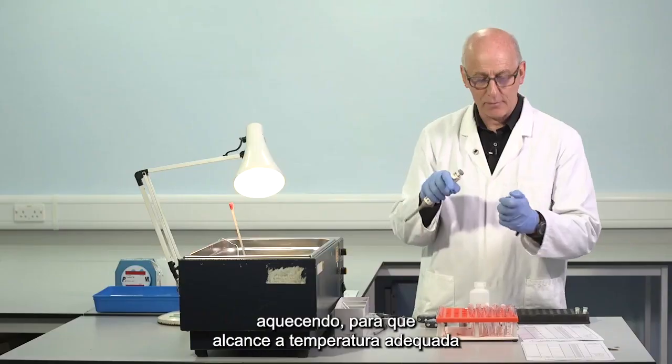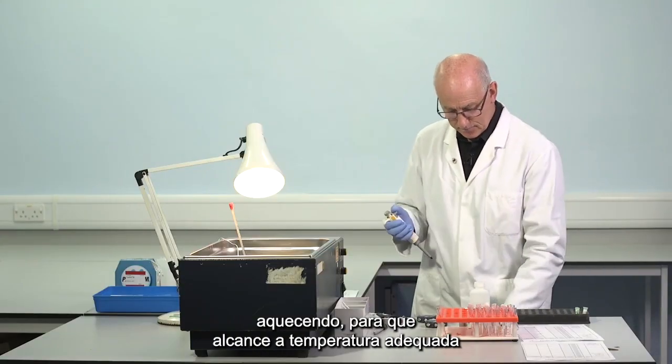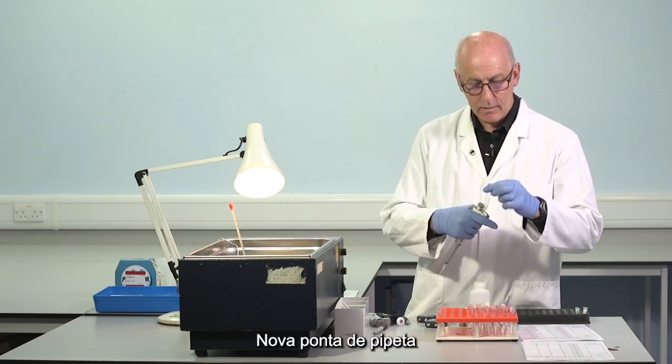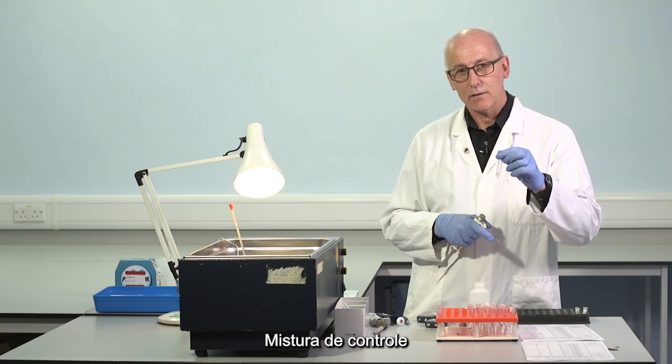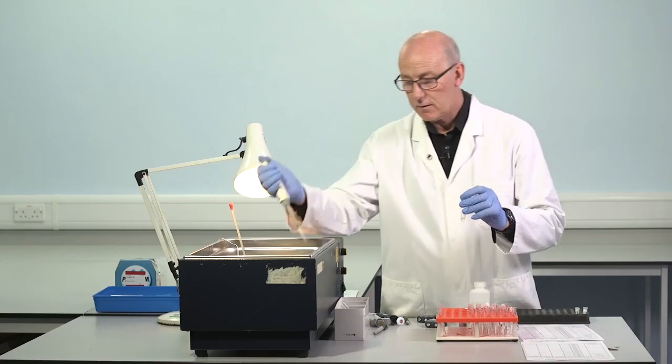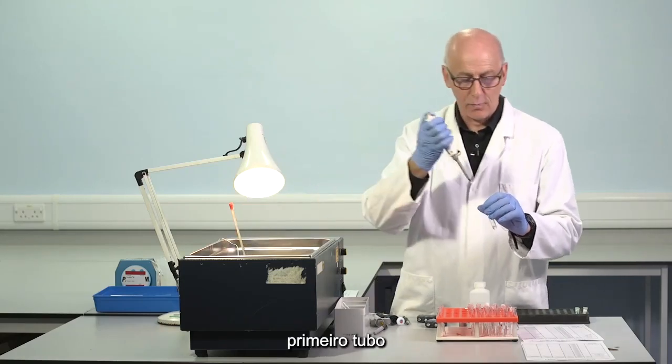Simply warming up to temperature at the moment. Fresh pipette tip. Control mix, diluted 1 in 5, 100 microlitres, first tube.